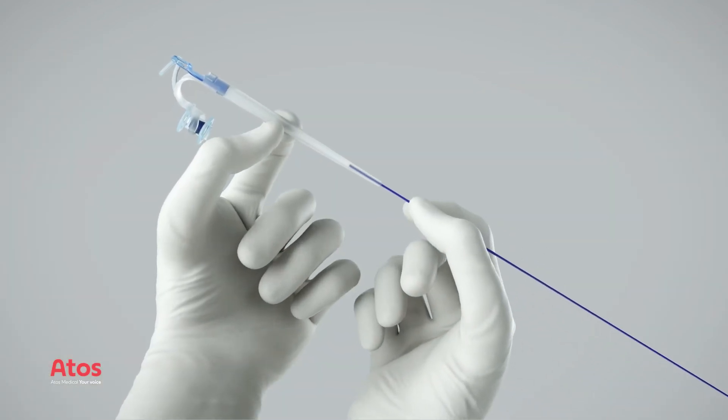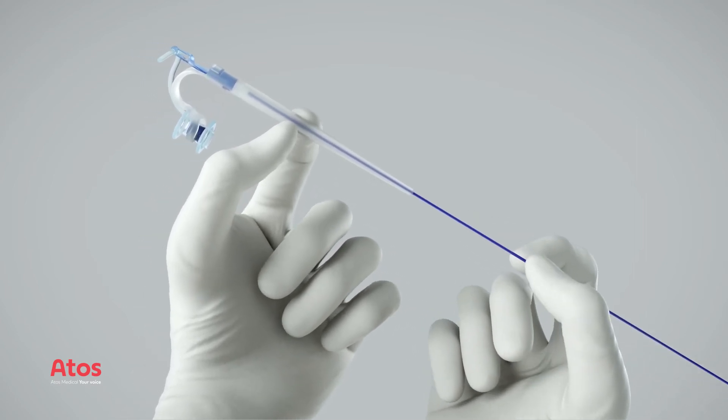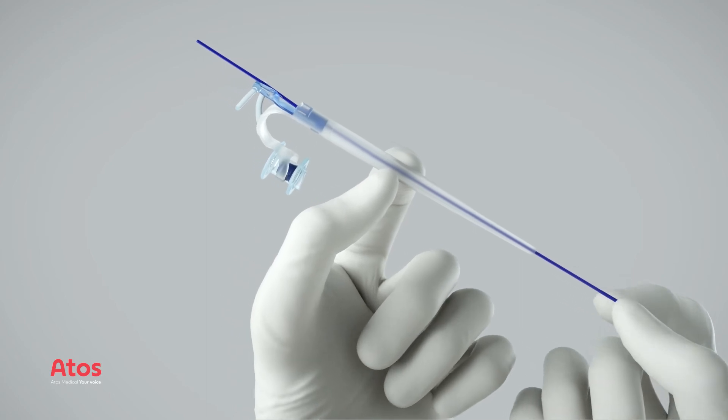Insert the guide wire into the puncture dilator and push the guide wire until it extends approximately 10 cm through the dilator exit hole.